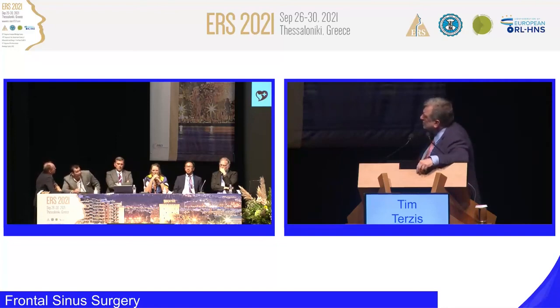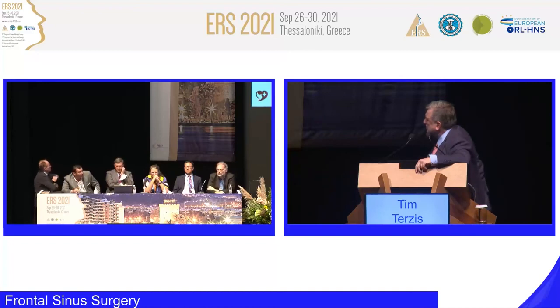Maybe it might be some thickening of the mucosa in the frontal recess. So this is why I'm thinking a surgical procedure will do good in the beginning, and the stent-eluting corticosteroids will be very nice to put there. Maybe this will be the solution. So small surgery and then steroids on inside.